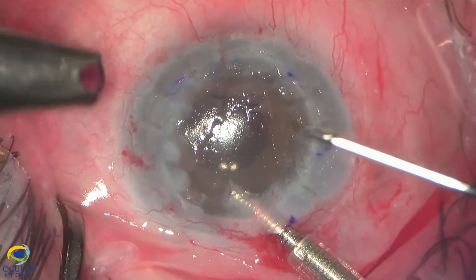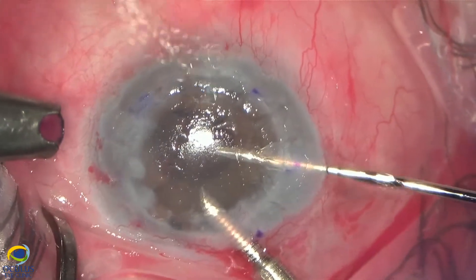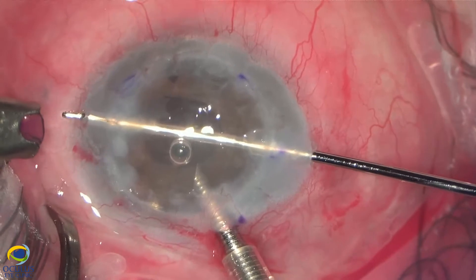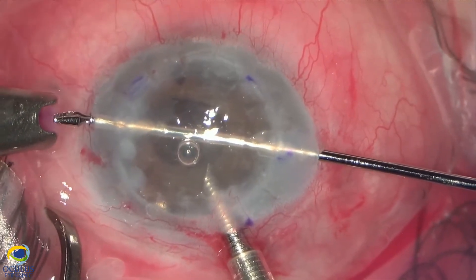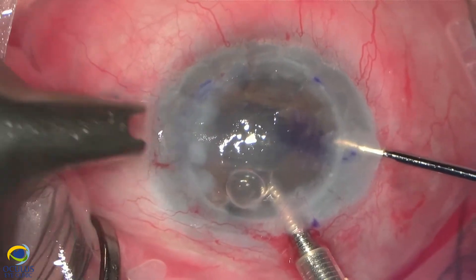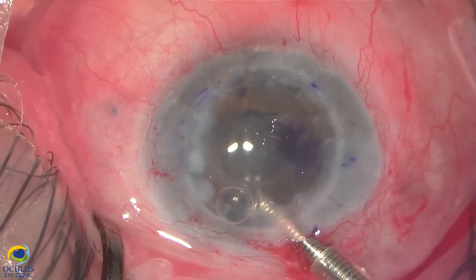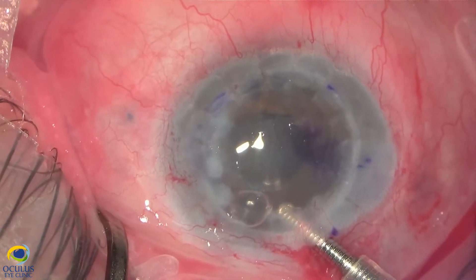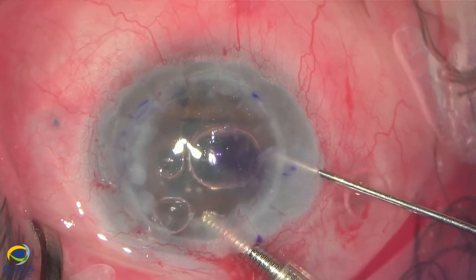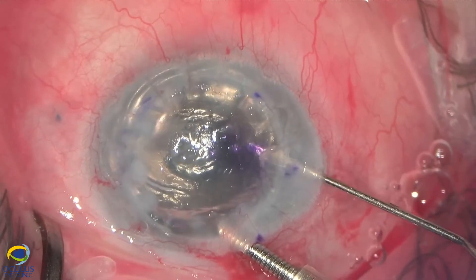Now, due to that spur which needs to be avoided, I go out on the other side with fine forceps and prefer to grasp the lamella outside the eye, then pull it carefully into the anterior chamber while moving the Busin glide towards the main incision. The infusion is now stopped but I'm keeping the maintainer in the anterior chamber just in case I lose air, and I inject more air under the graft lamella.